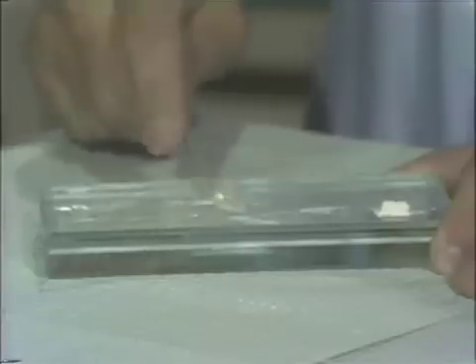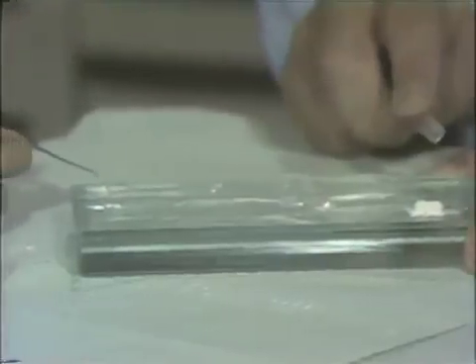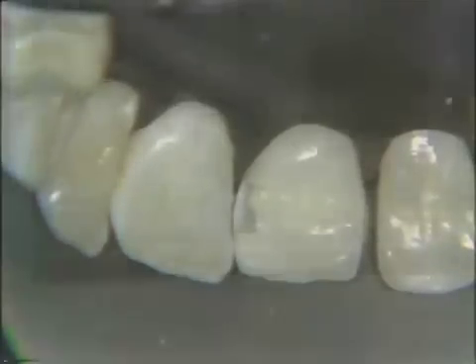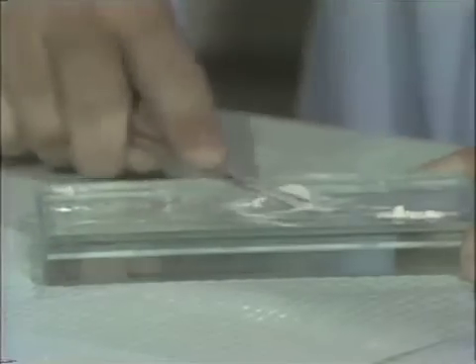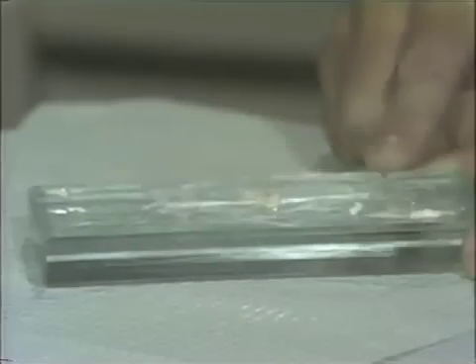Draws up about 1 inch, 1.5 inches, and then breaks off. That means that the primary consistency is just right. Note now the operator picks up on the point of a cowhorn explorer. Notice how small that is. And he's going to touch some retentive dots into the preparation on the axial wall, but away from the pulp as much as possible. You can see the two, cervically and incisally. In the meantime, the zinc phosphate cement is being mixed to a very heavy consistency that you can roll in your fingers and that will not stick to your fingers or the instruments.